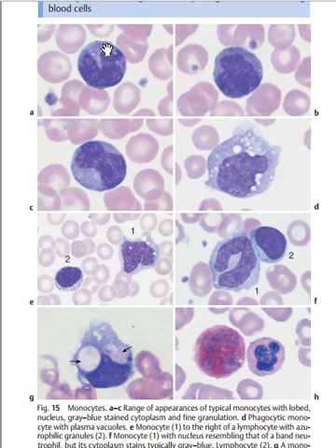From diagram A to diagram C, you can visualize monocytes. They are very large with gray-bluish cytoplasm, and they are not polysegmented. They are larger than neutrophils. That's the first thing that you have to know. And when they are larger than neutrophils, they are not polysegmented. So you see the nucleus is only like this, like a U-shaped nucleus, and the cytoplasm is bluish in color. Is it clear? Gray-bluish in color.